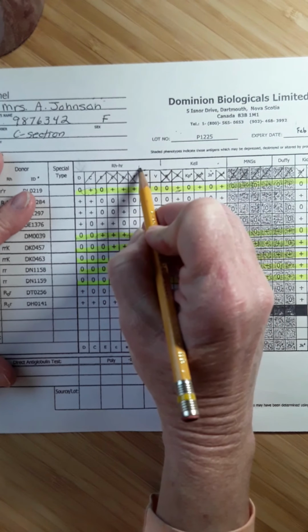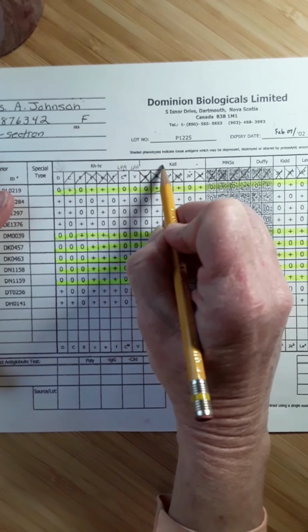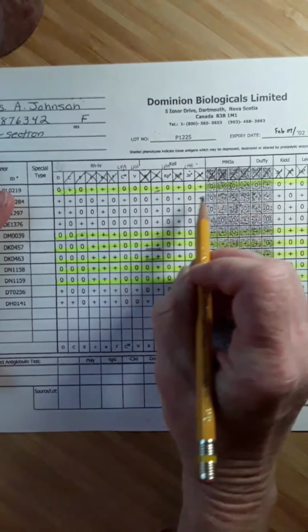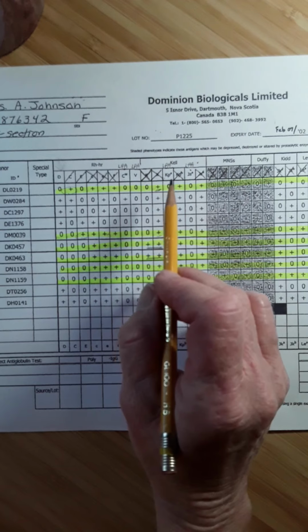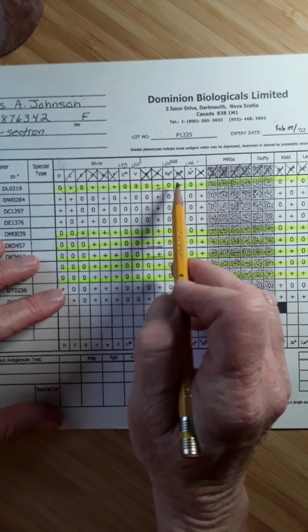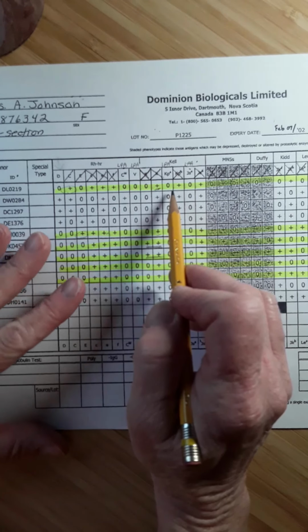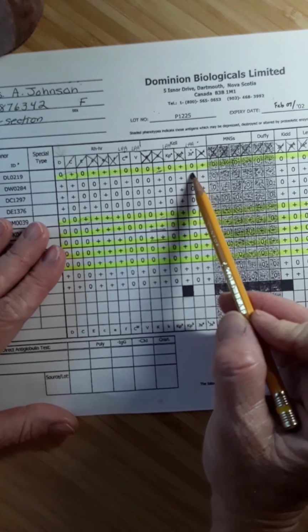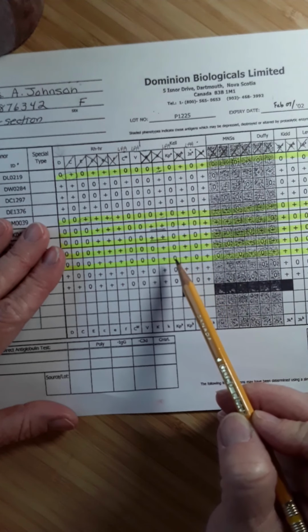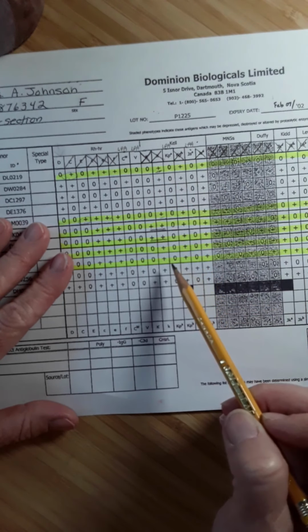On top of those, I just write LPA, and I'll explain why I'm doing that in a minute. KPA is an LPA as well, and JSA is an LPA. If you need a list of the low prevalence antigens, which is what LPA stands for, you can take a look at page 9 at the bottom of the page, where you can see them listed. I can tell they're LPAs as well when I look at a panel because they're almost all negative underneath the column. LPA stands for low prevalence antigen. So these antigens are not present on the majority of our population.